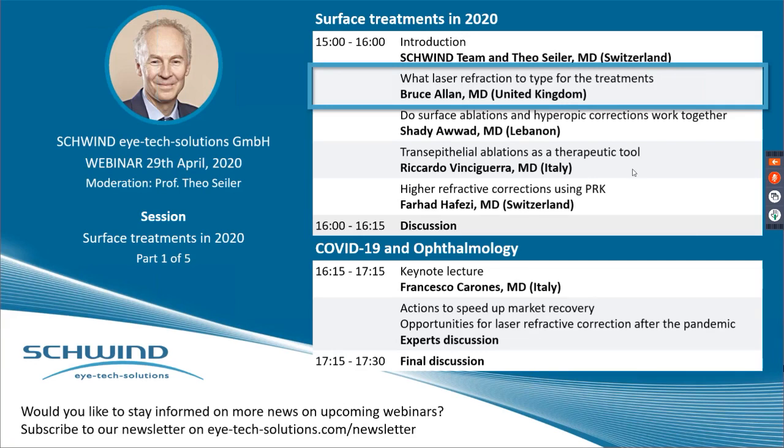Not everybody gets a good scan sequence, so you can't do wavefront treatments in everybody. And so in terms of our ranking of which treatment we use, we use wavefront treatments when we get a good wavefront scan sequence. If it's a normal eye, then we'll do an aberration-free treatment if we don't get a good scan sequence. If we've got an older patient, for example, a hyperopic treatment in somebody in my age group in their 50s, we would do an aberration-free treatment anyway. And so the advantage is really for routine myopic treatment there.